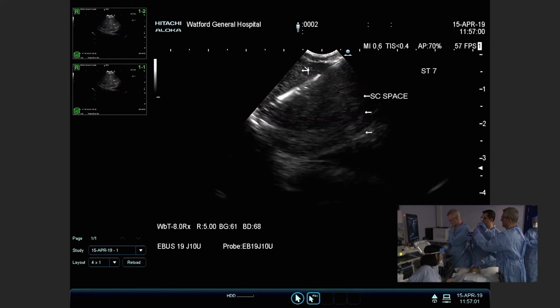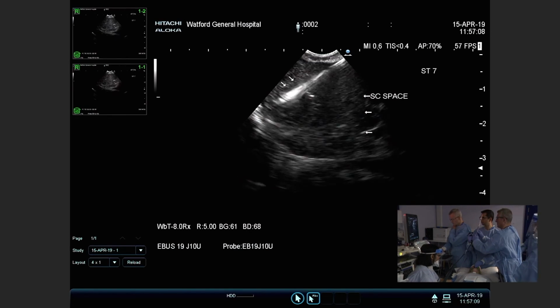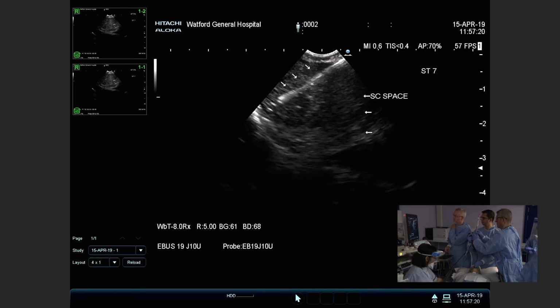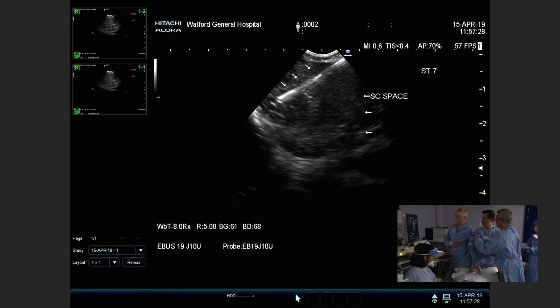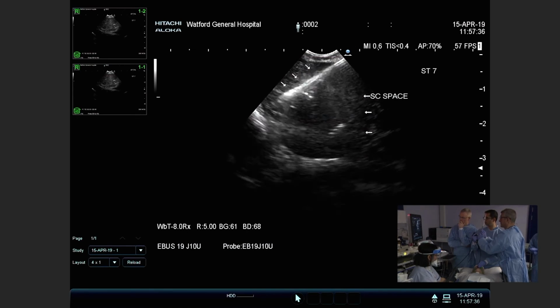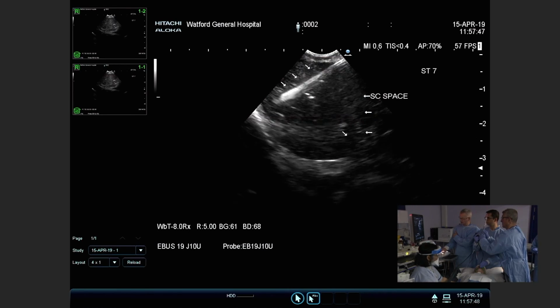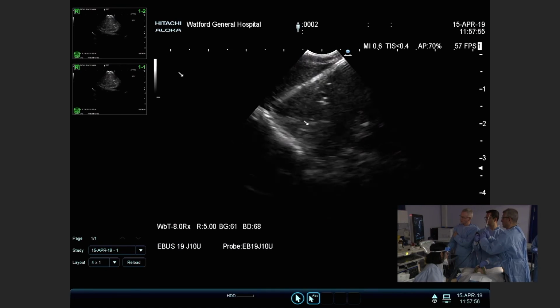We're on the last sample, sir, so hopefully another 30 seconds or so. So this is a very, very nice, very clear FNA pass. Again, for the benefit of the audience, it's very common to see the patient tends to cough when the needle is removed or withdrawn. As long as that coughing settles within a few seconds, it's fine. If it doesn't, you can always put some extra lignocaine. So again, we can see a few flecks of gas here. Indeed.